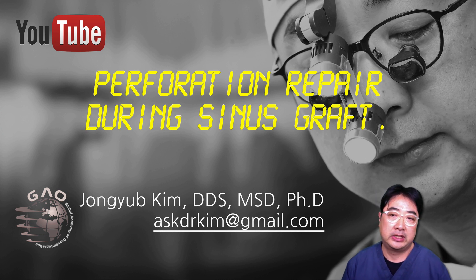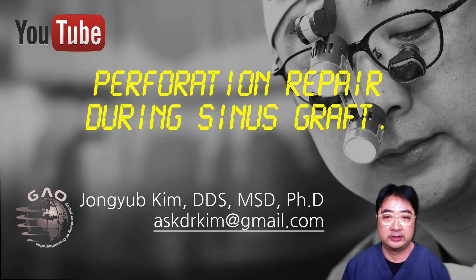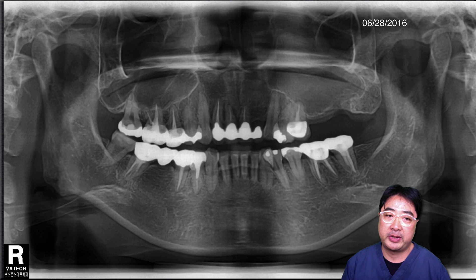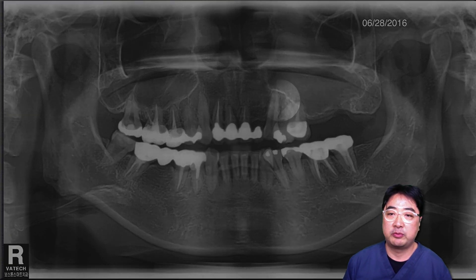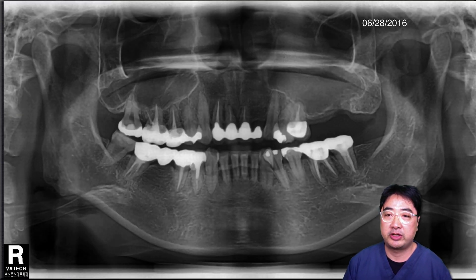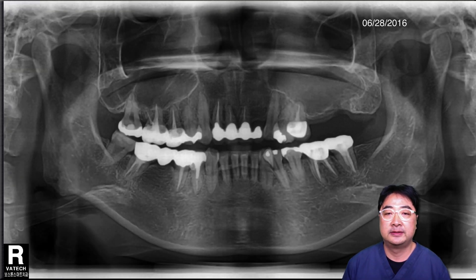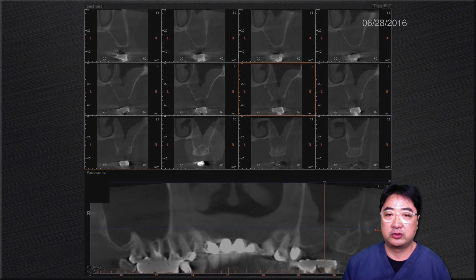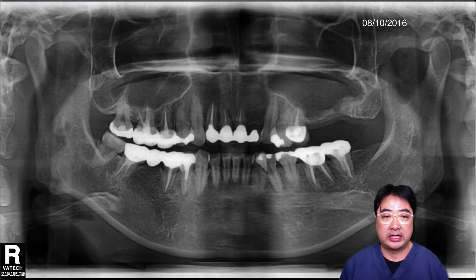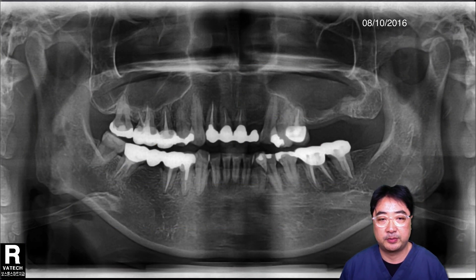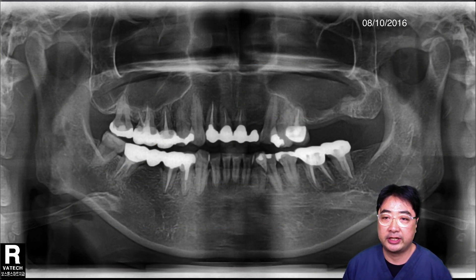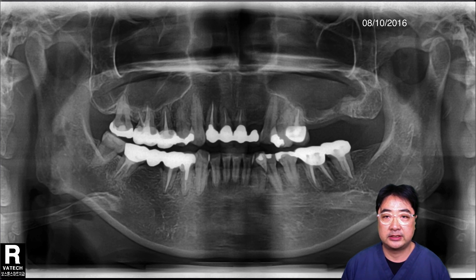I'm going to share a clinical case of perforation repair during a sinus graft. A 44-year-old female came to my office. This is the initial panoramic radiograph — you can see the haziness on the left side of the maxilla. From the CT scan, you can see mucosal thickening on the left side of the maxilla, so I referred the patient to the ENT specialist, an otorhinolaryngologic surgeon, and he gave medication including antibiotics for more than a month.